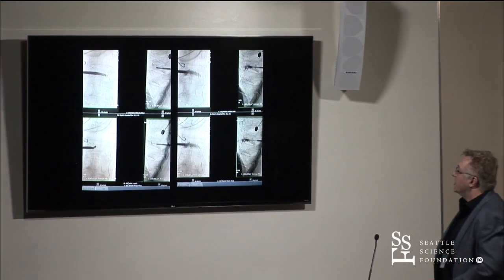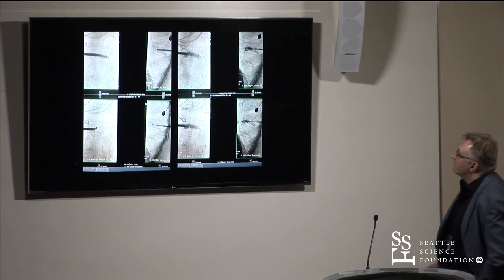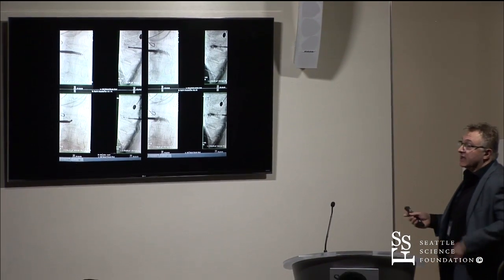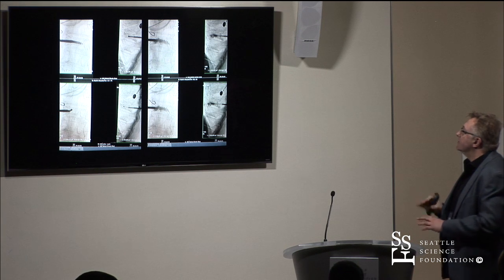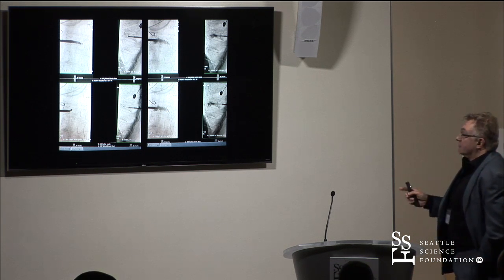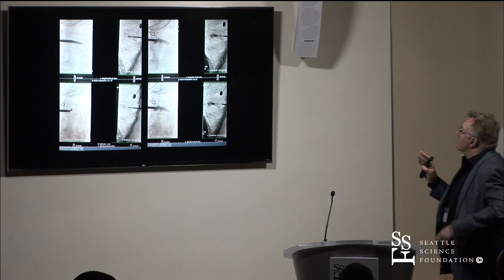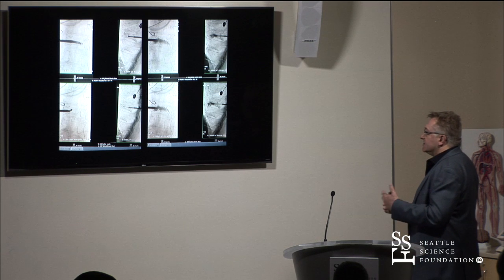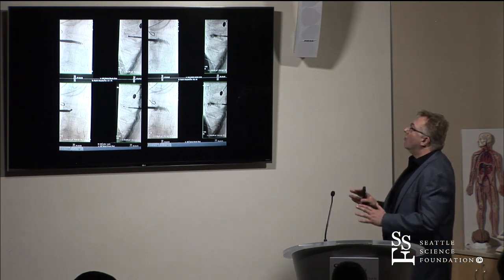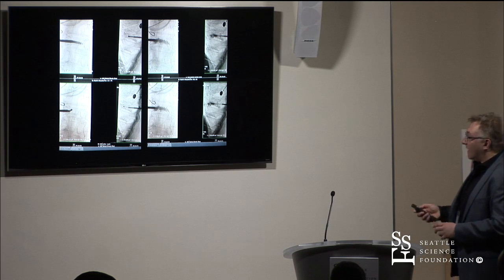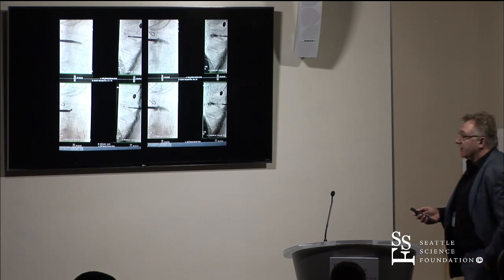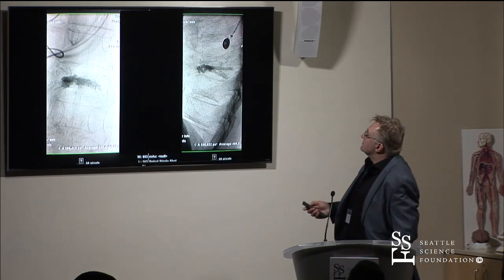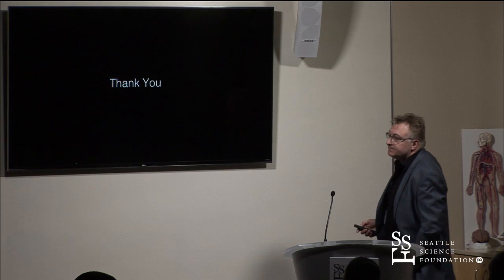This is not the typical distribution of cement — usually it's much more heterogeneous. This kind of looks more like a kyphoplasty for osteoporosis. I think less is more here. Unlike kyphoplasty where I'm always pushing for more cement, after a STAR ablation I know I'm going to get a good outcome with just ablation. For me, the cement is icing on the cake — I always do it, but I don't want to push it into places where I'll injure the patient. As the other speaker said, it will move to unpredicted places because it's soft tumor and the cortex is gone. There you go — AP and lateral, and that's it.